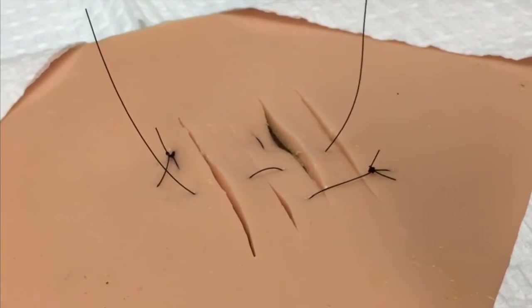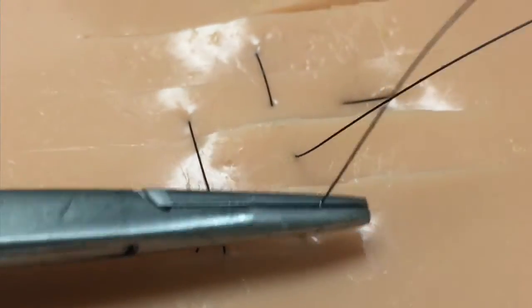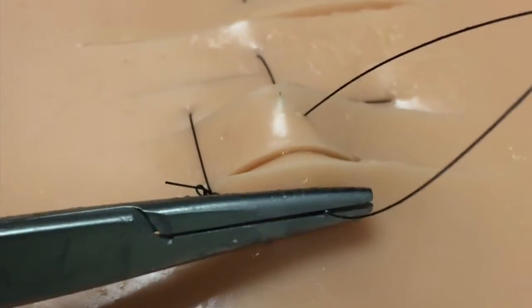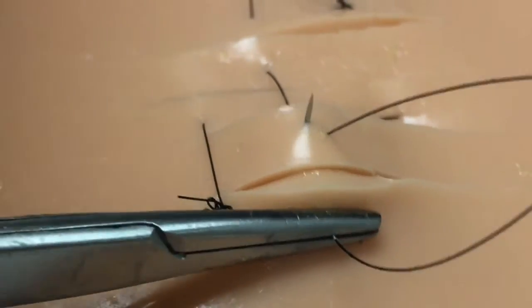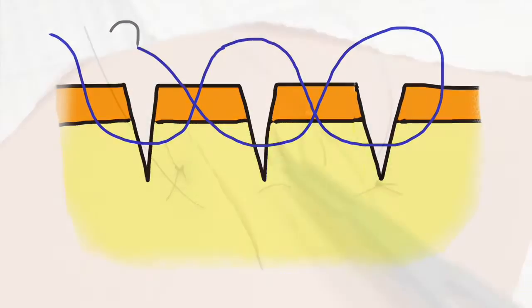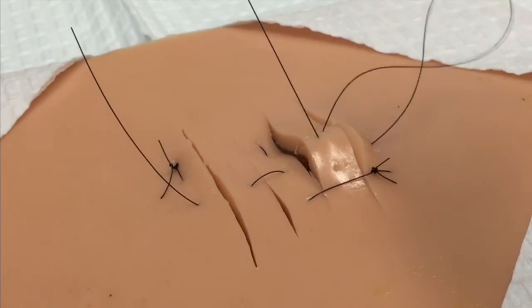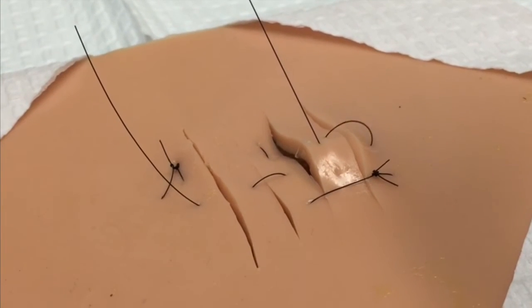By performing this technique, you've created a snake-like figure-of-eight type pattern. At this point, you'll turn the suture around, backhand it, and weave it through each of the intervening tissue islands in a similar fashion, piercing each of the tissue islands and weaving the suture, thus creating the final figure-of-eight appearance. You'll continue to weave this same pattern back to the side upon which you started.